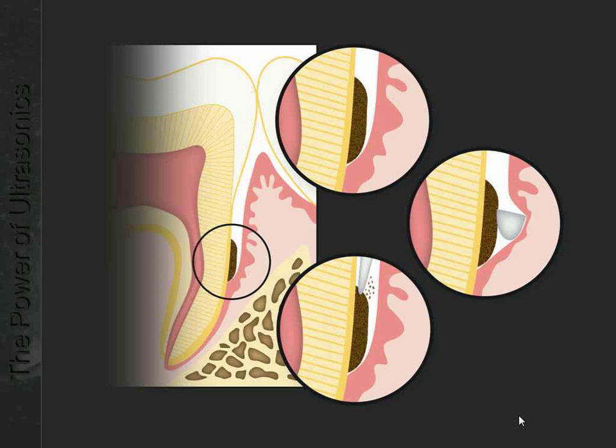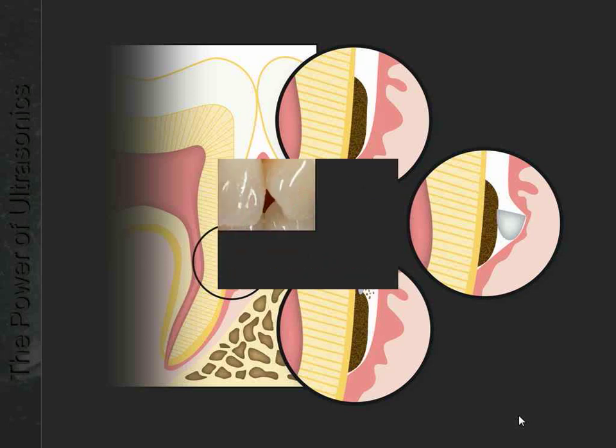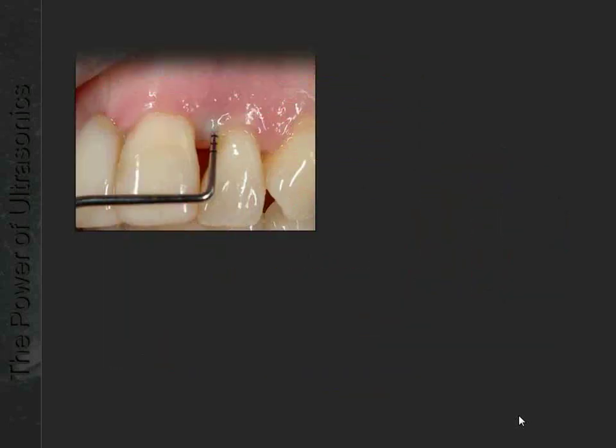So reaching down, working your way down, you're already cleaning the tooth surface if you have an ultrasonic instrument. So probably this is why you reach down deeper with the ultrasonics as compared to a manual curette. And for instance, in this case, if you have a pocket like this, which is 8 millimeters at this lateral incisor, you already see the gingiva turning white.